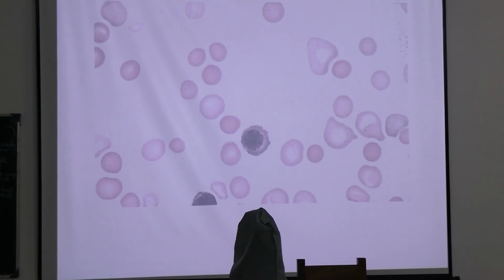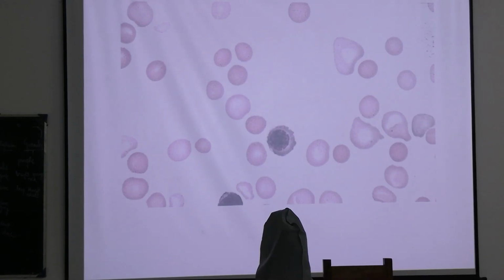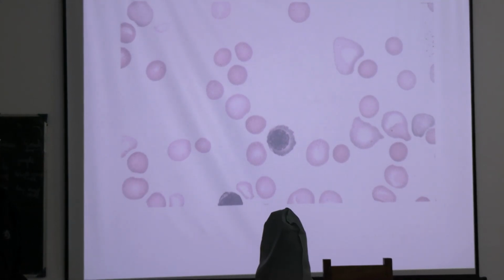No one? Okay. Now, can you tell me the description of a neutrophil? Describe a neutrophil.